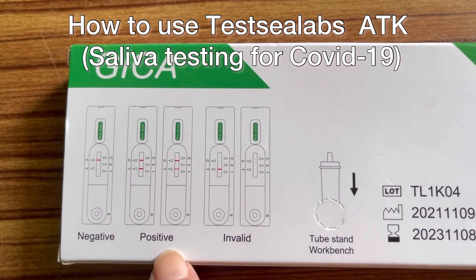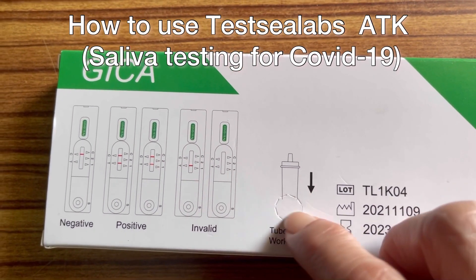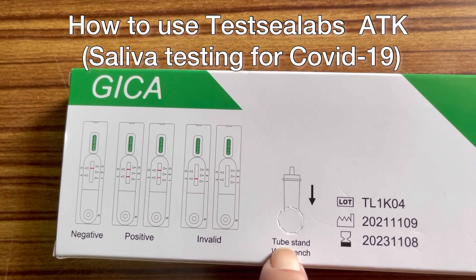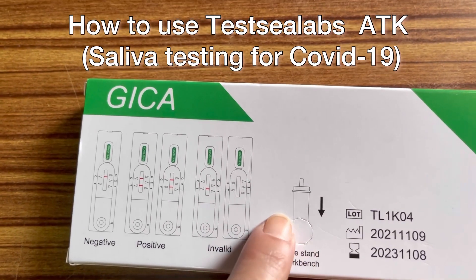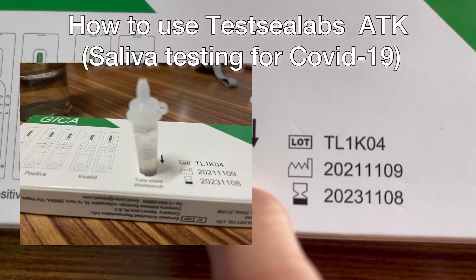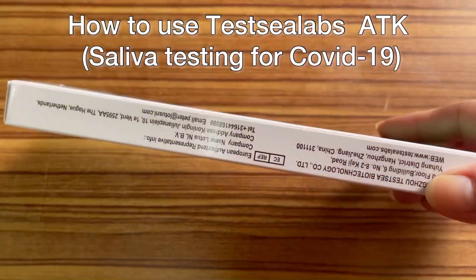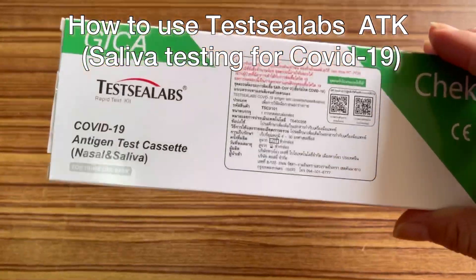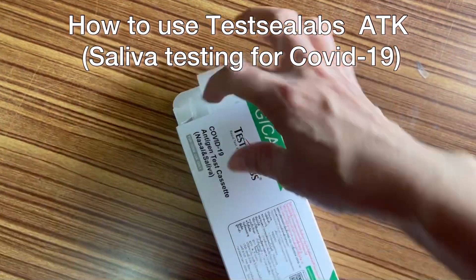Here you can see negative, positive, and invalid indicators. You can put the tube here — this is the workbench stand. You can make a hole here. How does it work? I don't know yet, so let's see what's inside the box.